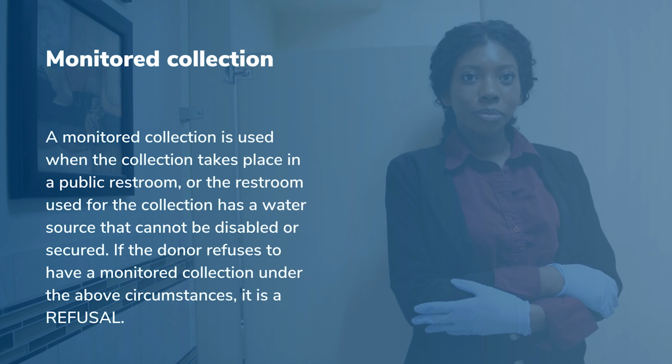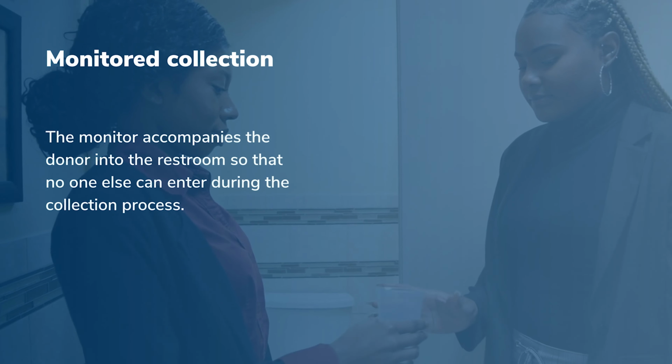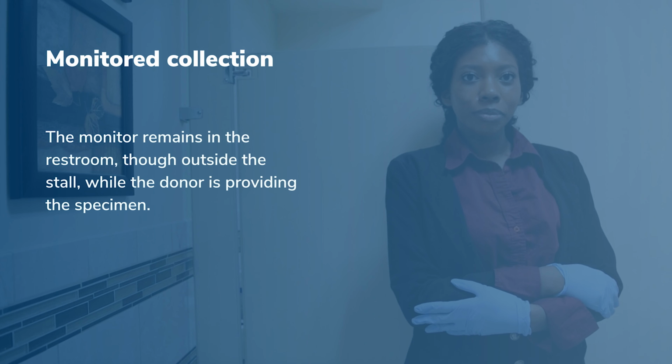Monitored collection. A monitored collection is used when the collection takes place in a public restroom, or the restroom used for collection has a water source that cannot be disabled or secured. If the donor refuses to have a monitored collection under the above circumstances, it is a refusal. A monitor may be the collector or an individual other than the collector, and is not required to be a trained collector. The monitor must be the same sex as the donor, except if the monitor is a trained medical professional. The monitor accompanies the donor into the restroom so that no one else can enter during the collection process.